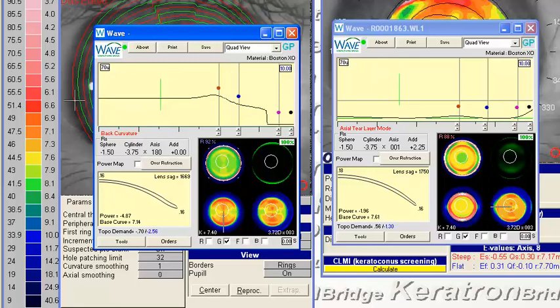So now you're assuming this lens is going to correct about 3/4 of the corneal cylinder. And then I think you're going to get a lens that's going to probably sit a little bit more nicely. If we look at the actual lens itself, you've got a lens that's aligning very nicely on the cornea. You may need to clean this up a little bit looking at the edge lift and considering between axial or tangential.